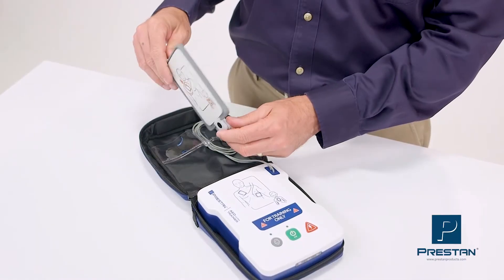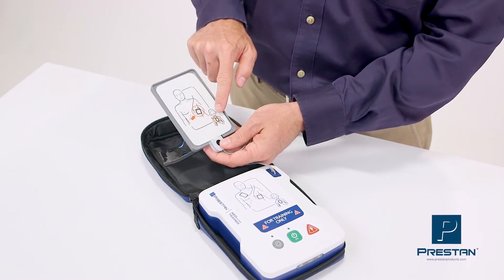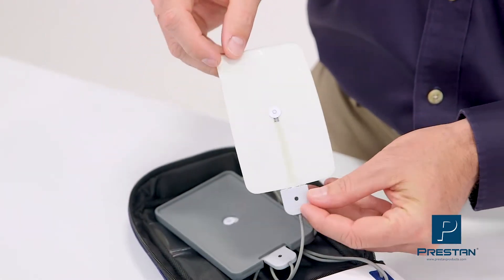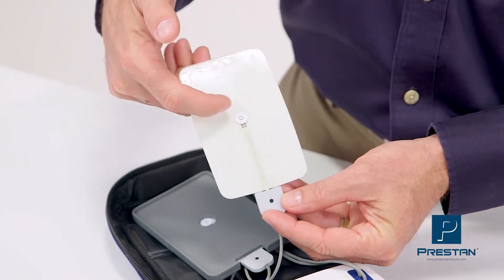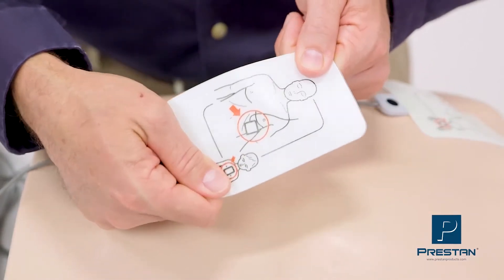The Preston AED Ultra Trainer is equipped with a dual-graphic pad and Preston's unique pad-sensing system, which automatically detects when each pad is placed on the mannequin. This most accurately simulates a live AED.